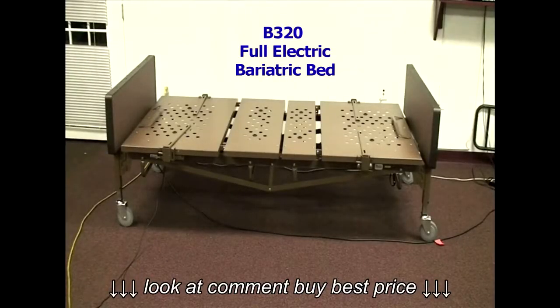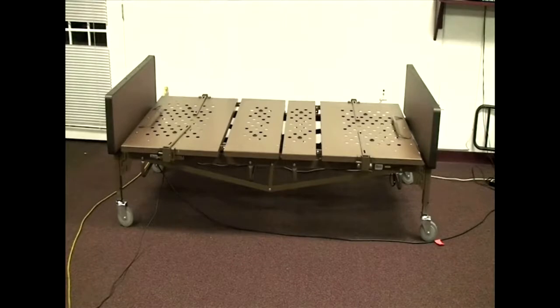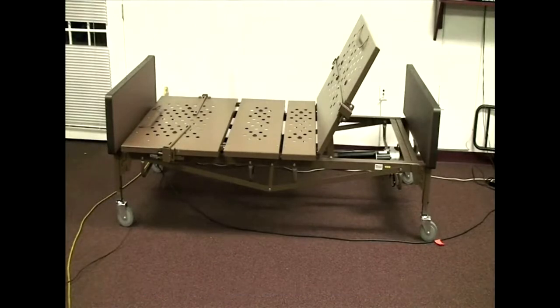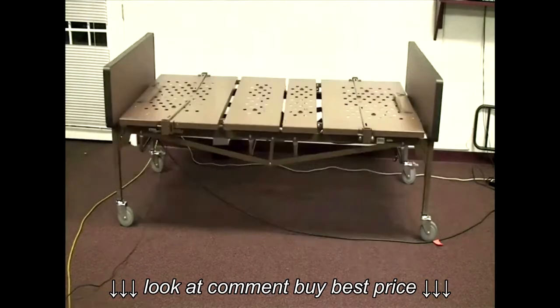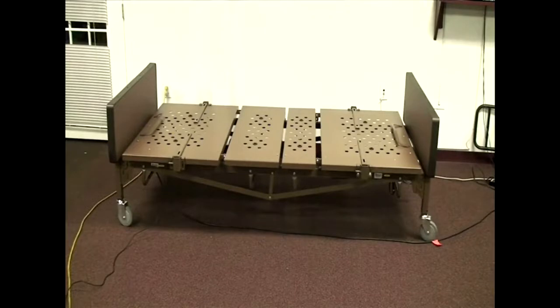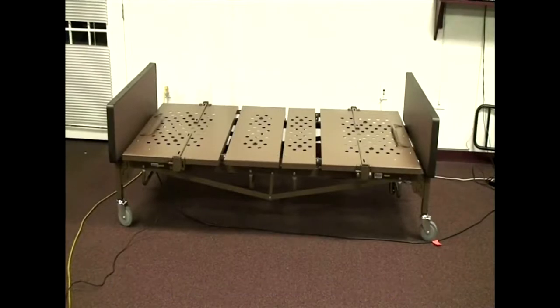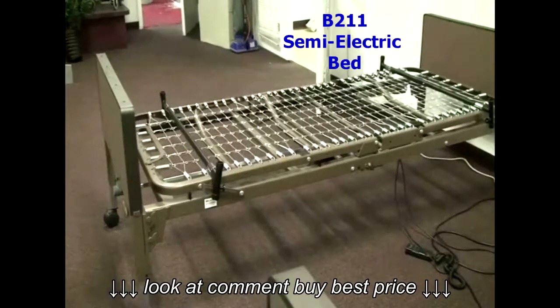This is our B320 full electric bariatric bed. In a full electric bed, three sections are motorized: the head section can be raised or lowered by motor, the foot section can be raised or lowered by motor, and the height of the bed can be raised or lowered by motor. On a semi-electric bed, only the head and foot sections are motorized. The height is changed by a manual hand crank on the footboard. Today we'll take an in-depth look at our B211 semi-electric bed.